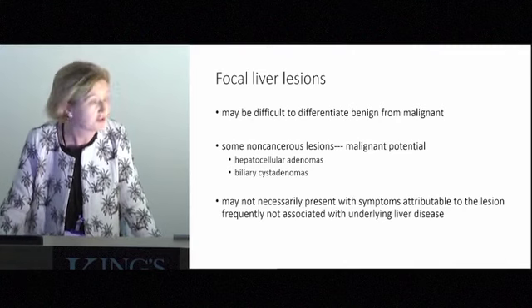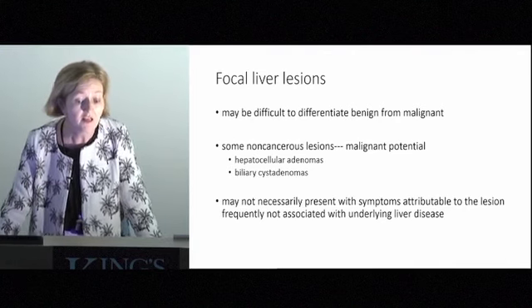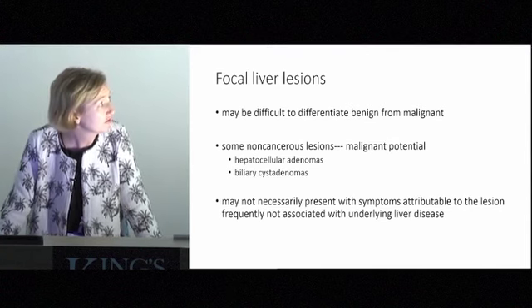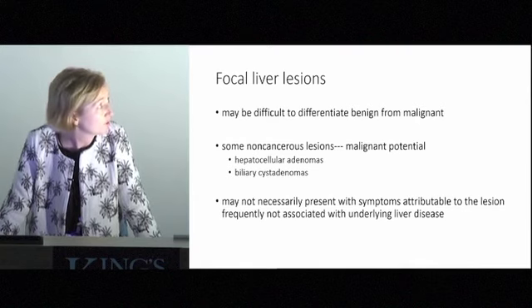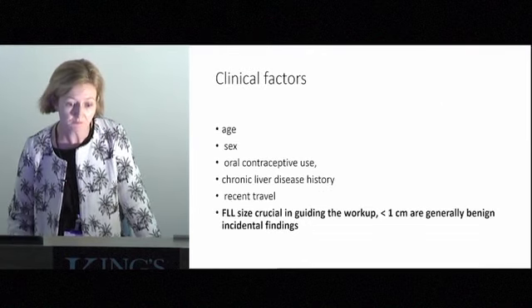It can be difficult straight away on your grayscale imaging to differentiate benign from malignant, and some non-cancerous lesions will have malignant potential, so you have to have a sort of a treatment strategy or a spiel to give the patient before they leave. But the most important thing to remember is that it's probably not going to be something that's ever going to cause them further concern.